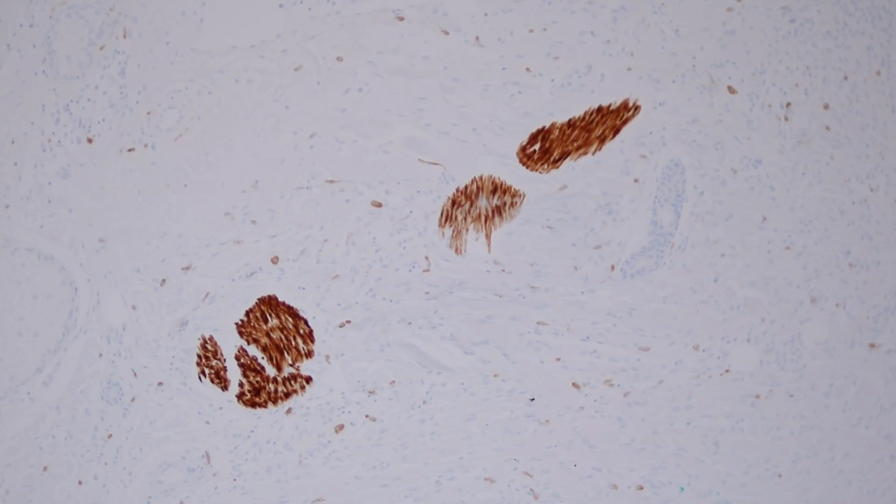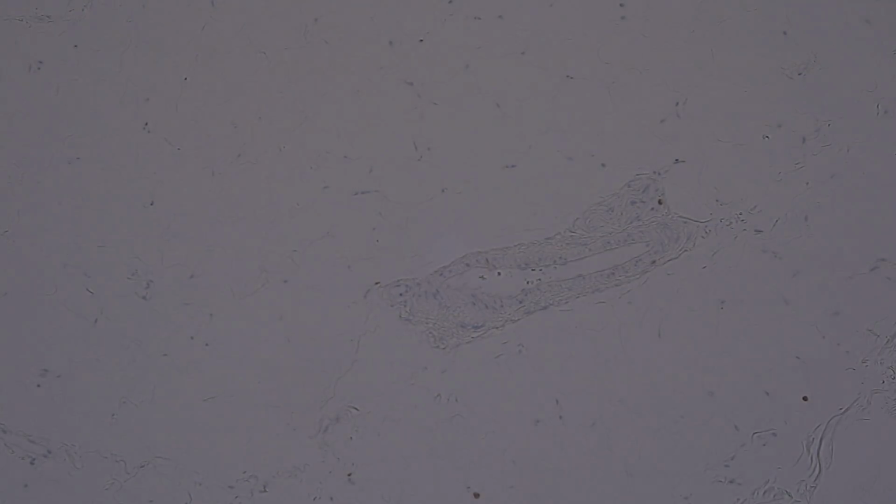And the other place in the skin that you have muscle is in the walls of vessels. But I find in my experience that the muscle in blood vessel walls stains with actin pretty well, but it's much weaker or even sometimes negative for Desmin. So I'm trying to find an example here of a vessel that's picking up with Desmin, and I'm really having trouble finding one. There may be, here, let's see. Yeah, for example, here's a vessel wall. And you see almost no Desmin expression here. It's almost totally negative. So I find that looking for the muscle of a muscular vessel, looking at it with smooth muscle actin is going to highlight it much better.